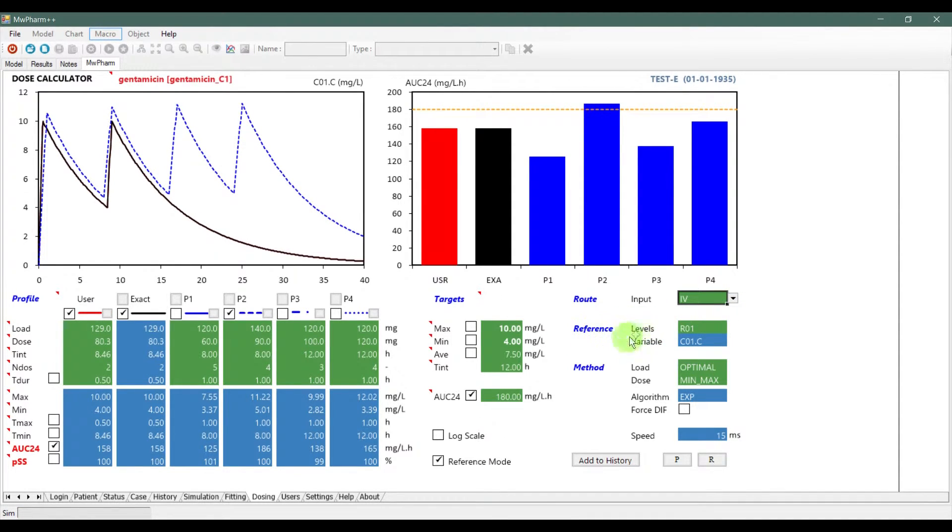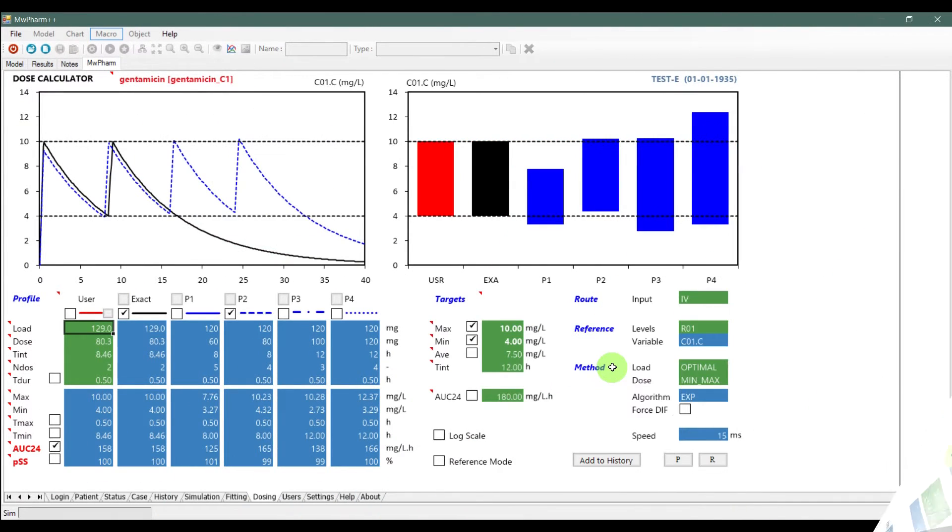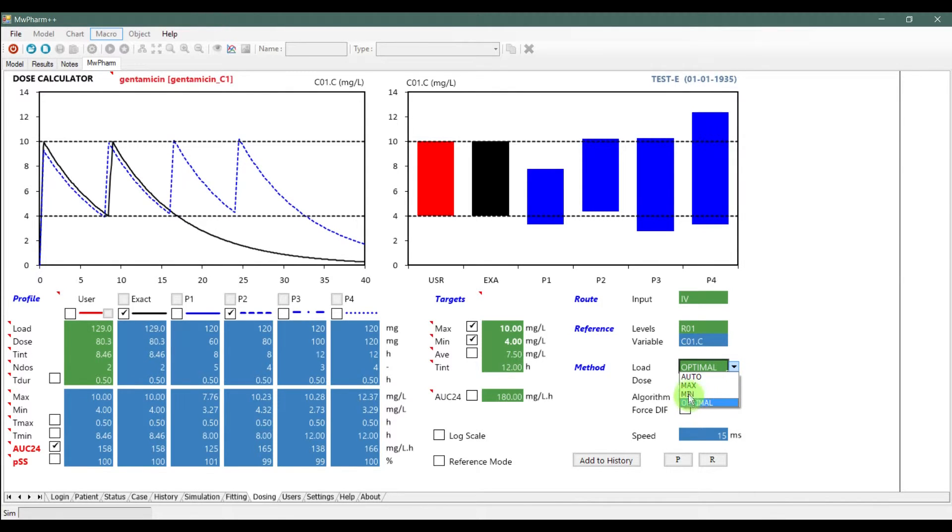In the reference section, you will see what your target object is. In the method section, you can choose different kinds of load. I recommend you leave the optimal setting here.